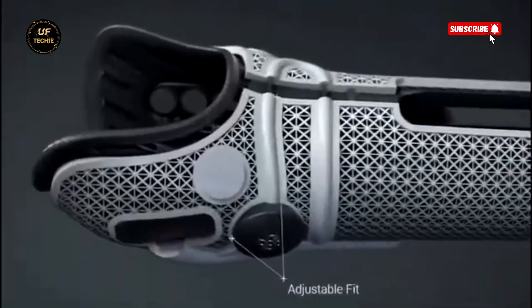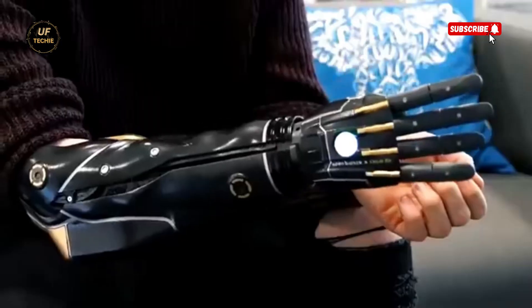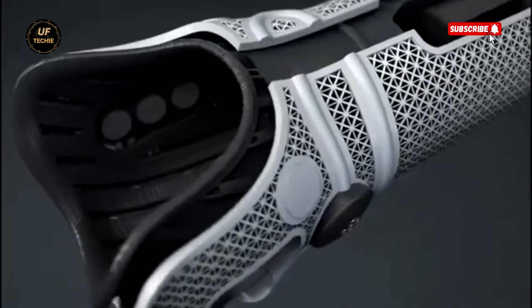Every finger on the Hero Arm moves independently, mimicking natural hand movement. It offers haptic feedback and visual cues through lights and vibrations, letting users know when they've successfully completed a task like picking something up.